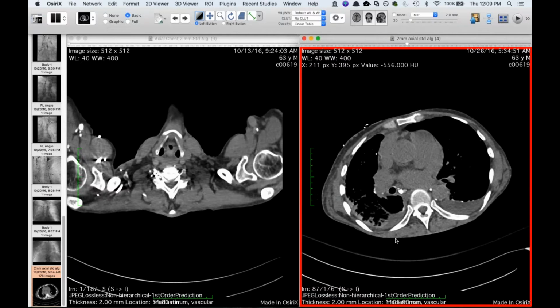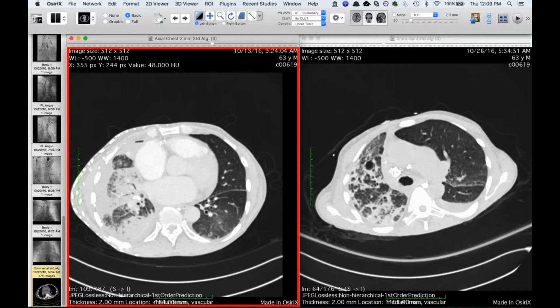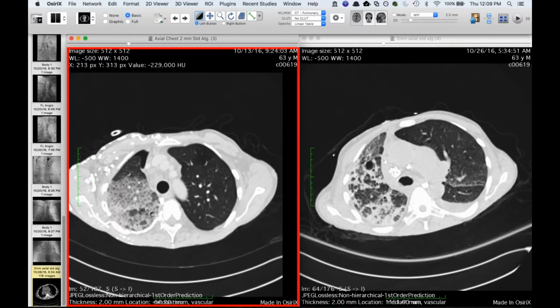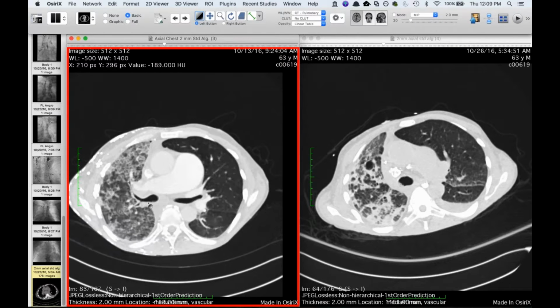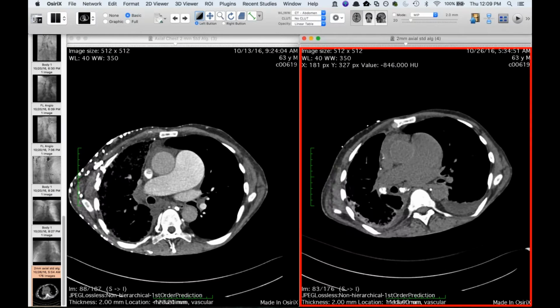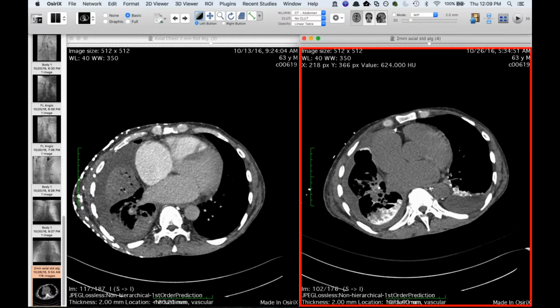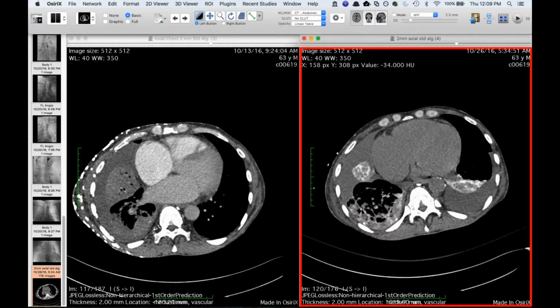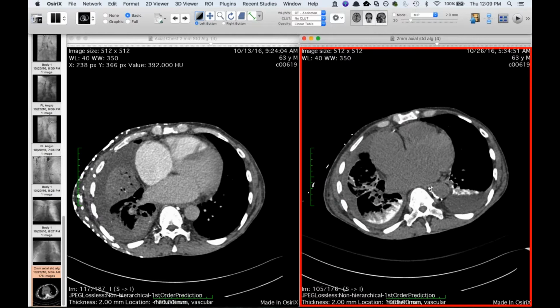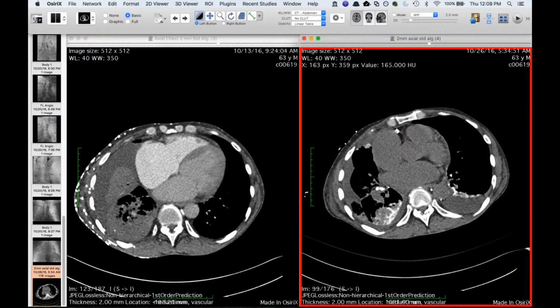And now look at the attenuation of his lung here. And you can see a marked difference. And he also has more of a crazy paving pattern with septal thickening and fluid cuffs and some ground glass opacity. And so when Kim showed this to me, at first I was wondering, since he has end-stage renal disease, was this just calcification like we've seen with the heart of stone, where you get rapid calcification in the setting of some sort of renal insufficiency and calcium and phosphate imbalance.